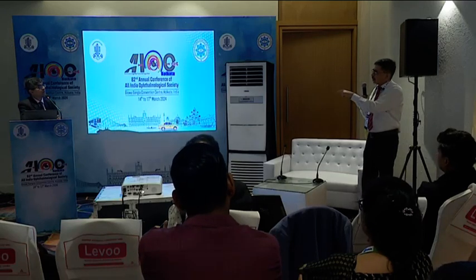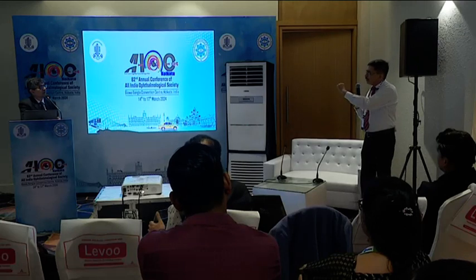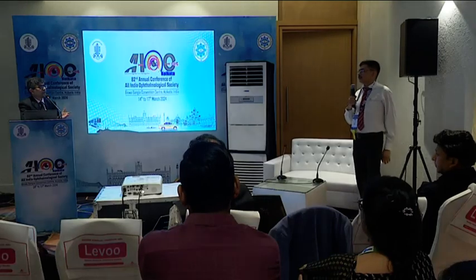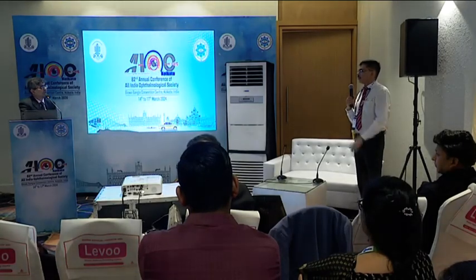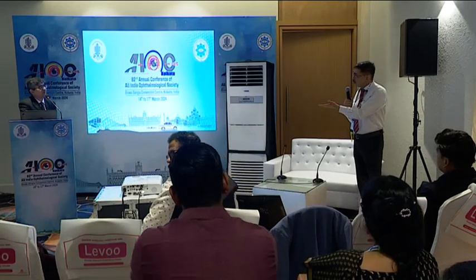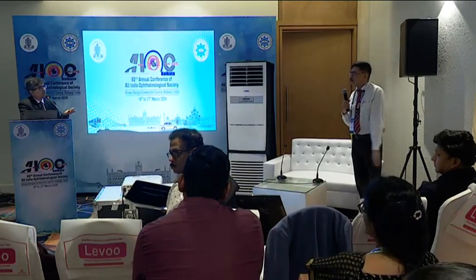So there also, I think you will have some gadgets in which it's easier to insert it through the retina. They have a steel tip. No, we don't need a steel tip. We need something malleable. I think this just works. Worried about the penetration part of it? No, no, it easily penetrates. It should not be a problem, because the retina is friable already, with the tumor over it, so it easily penetrates.